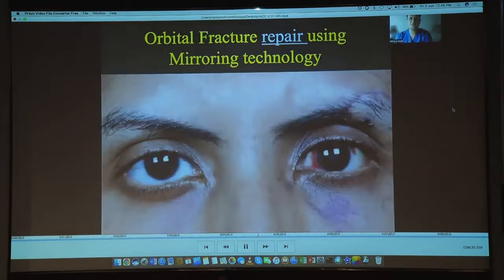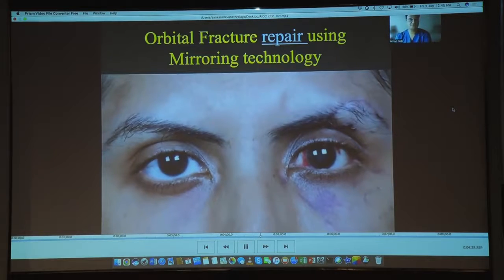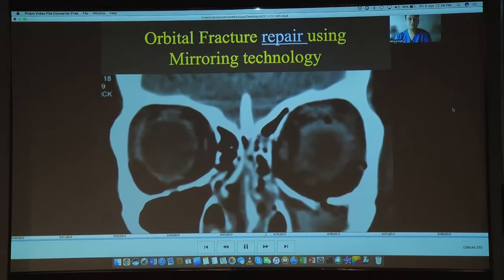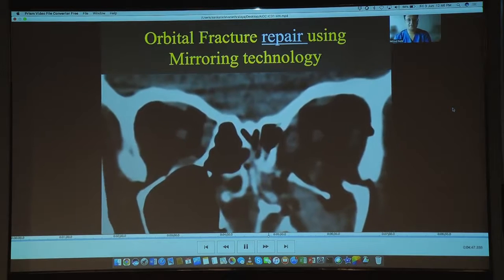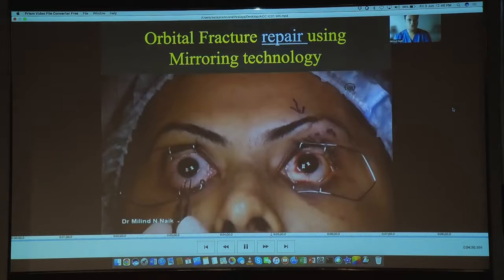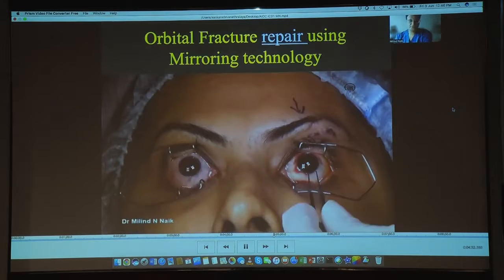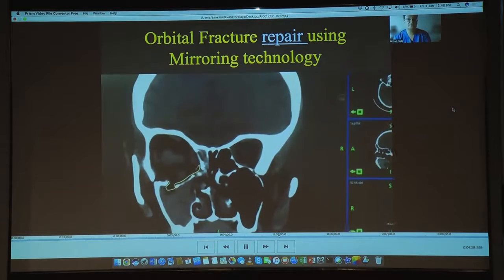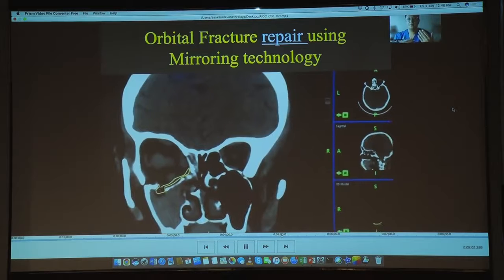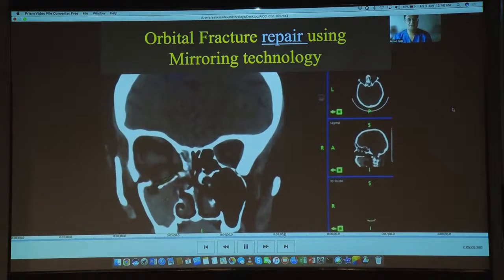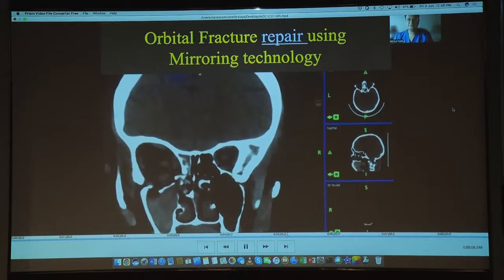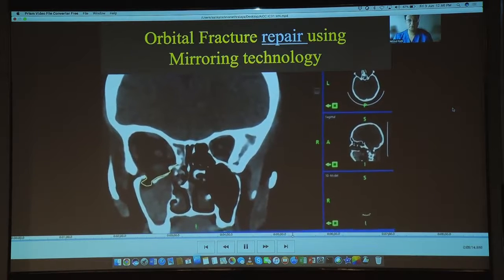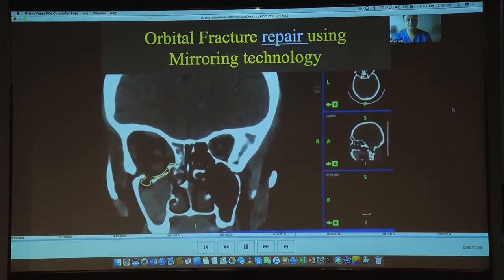Coming to orbital fractures: here is a patient with a left orbital fracture with significant enophthalmos. Imaging shows a floor and medial wall fracture expanding the orbital volume. One of the ways to restore this volume is to first measure how much volume has been lost or expanded. Navigation technology allows every coronal cut to be assessed for the expanded volume, which builds an eventual three-dimensional image of the total expanded area so that orbital plating can be planned accurately.